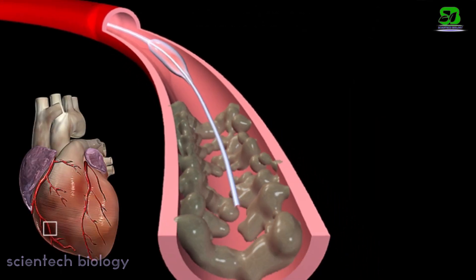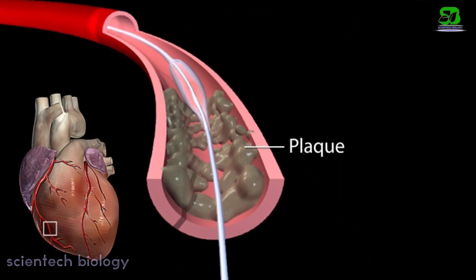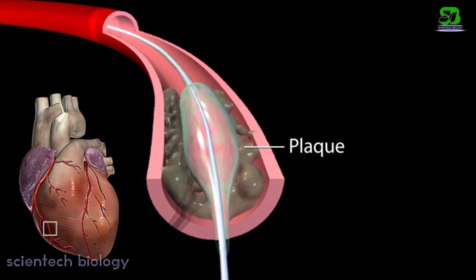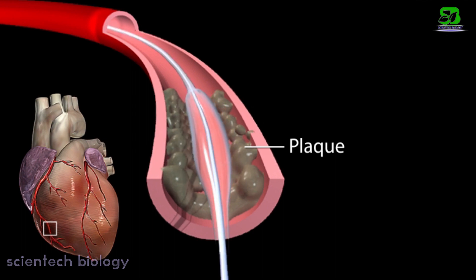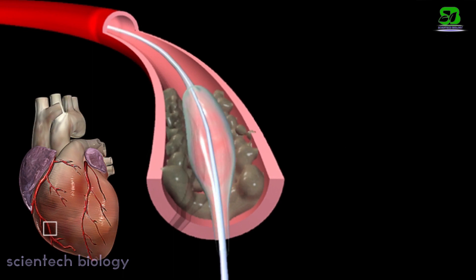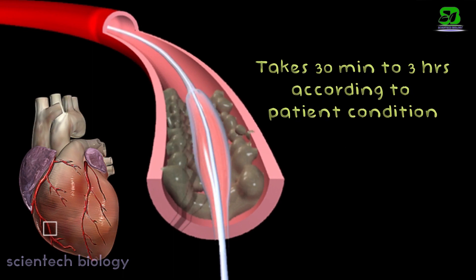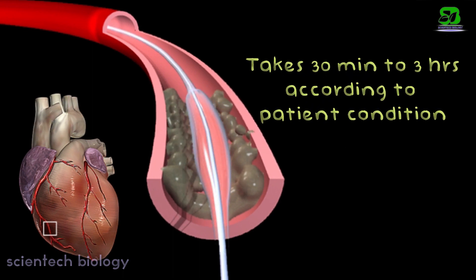In balloon angioplasty, a specially designed tiny balloon attached to the guide wire is inserted into the narrow section of the coronary artery to compress the plaque. This opens up the artery and allows free flow of blood. This procedure takes 30 minutes to 3 hours depending on the patient's medical condition.